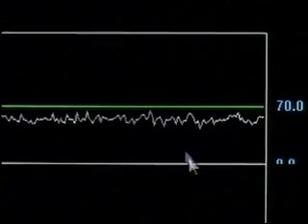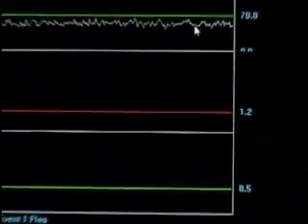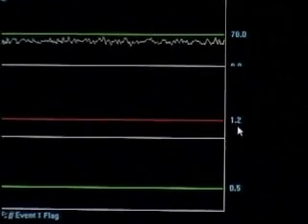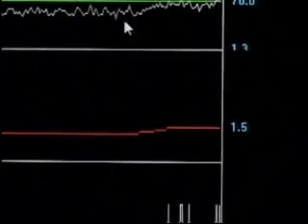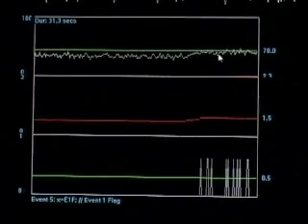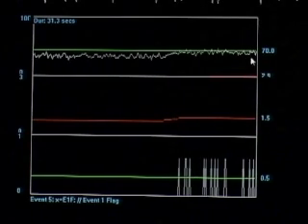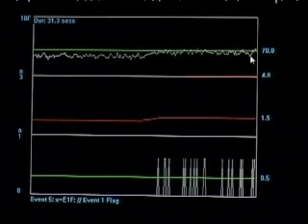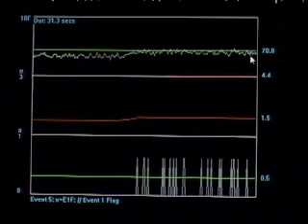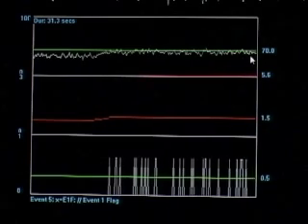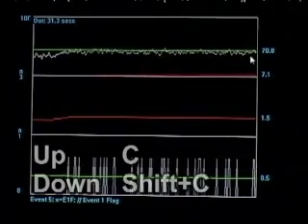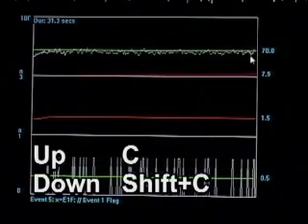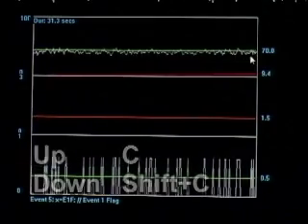In this current scenario we see we're getting no feedback at all. We might need to make this bullseye a little bigger. I do that by hitting the U key and I'm going to take it to 1.5. When I do that, the percentage of z-scores that can meet that new criteria climbs up and now I'm starting to get feedback at that 70% again. I can also adjust the percentage of z-scores required to meet criteria to get reward by using the C key — up is C, down is Shift+C. For standard deviation adjustment, up is the U key, down is Shift+U.